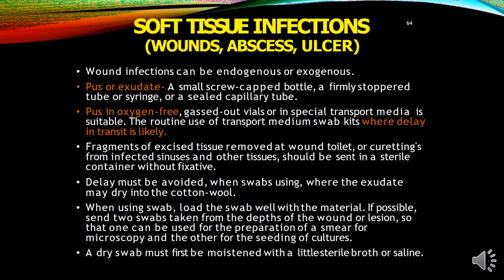Fragments of excised tissue removed from the wound, toilet or curettings from the infected sinuses and other tissues should be sent in a sterile container without fixative. Delay must be avoided, and swabs containing the exudates may dry up, so use moist cotton. When using swabs, load the swabs well with the material.